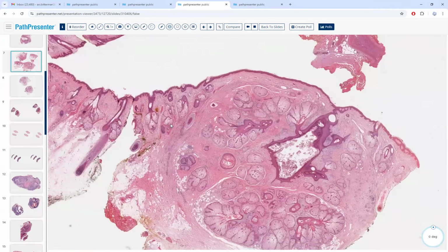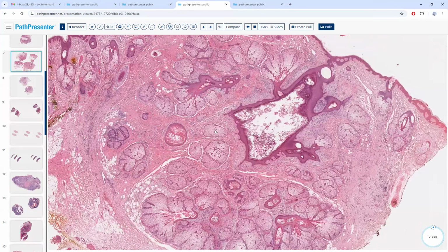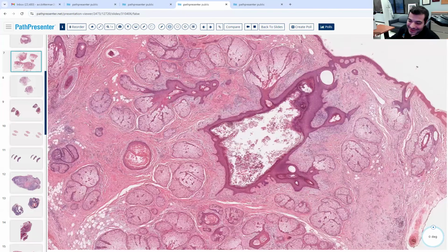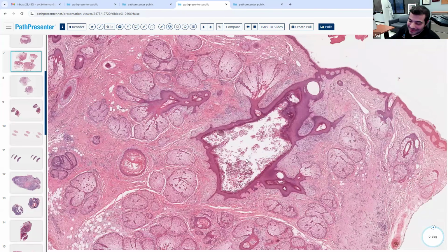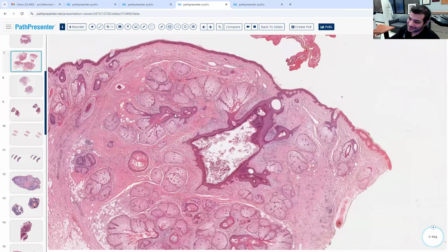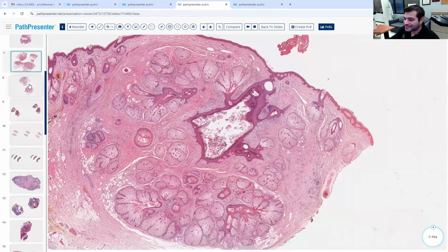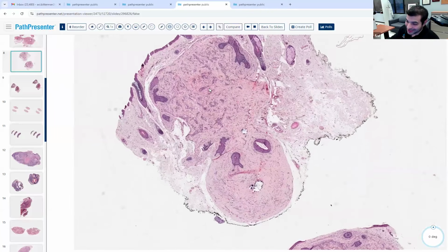It's like you just named it: follicular sebaceous cystic hamartoma. Yes, good. That's just the entity that it looks like. It's sort of lower yield, but once in a blue moon you might see that on one of your exams, as opposed to this, which you definitely have to know.